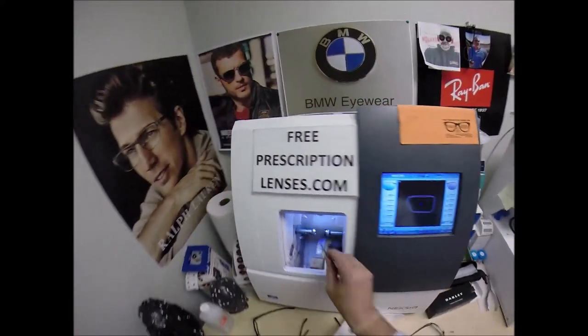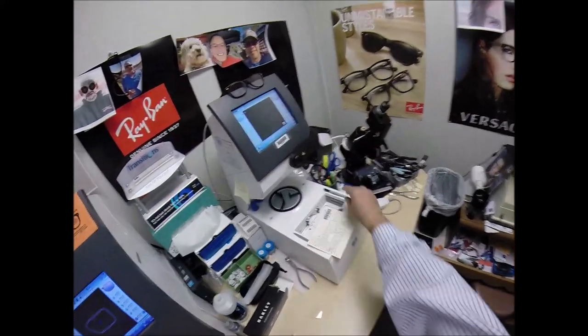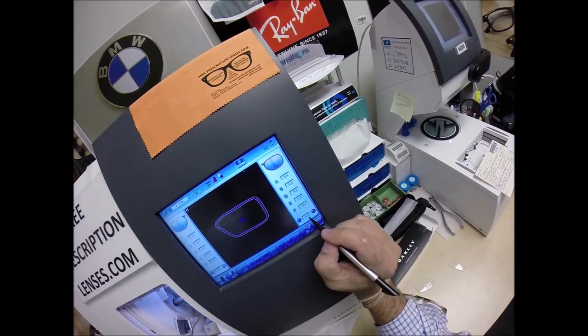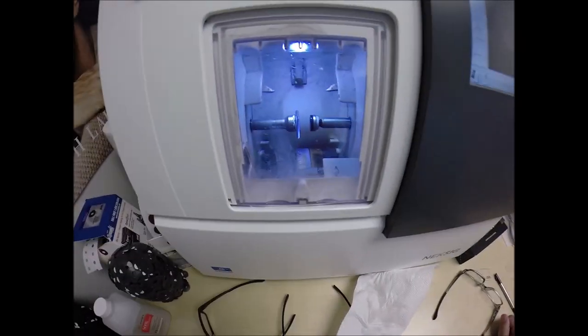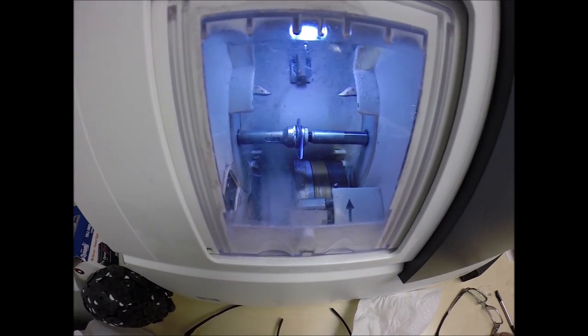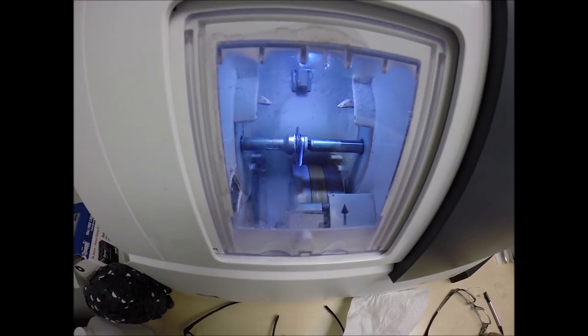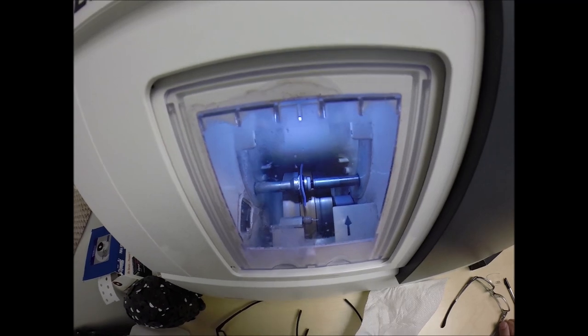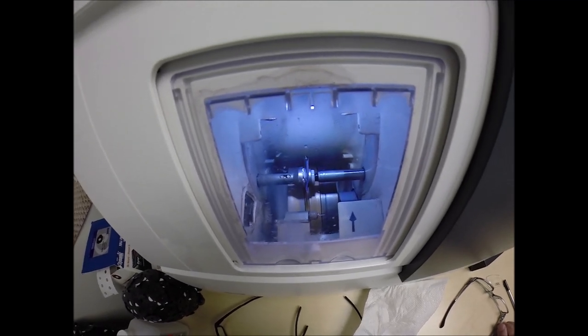Let's do another tenth of a millimeter. Where's that stylus? 1/20th of a millimeter, 1/10th. Hit retouch. Just like before, the clamp shuts. And instead of going to the cutting wheel, it's going to drop down to the wheel in the center of the bevel wheel. You can always cut more off of a lens. You can never add it back on. So I'm glad it starts a little bit large and works its way down.